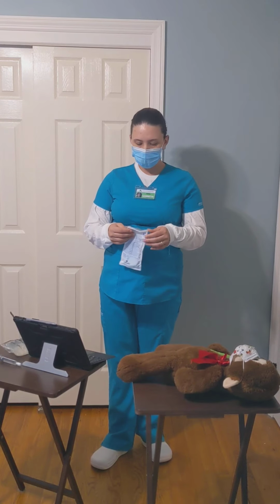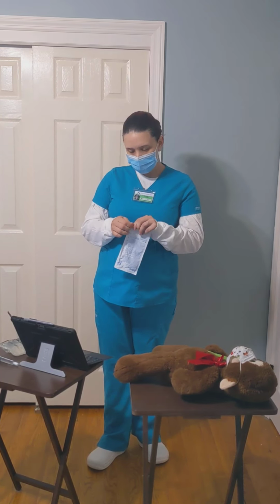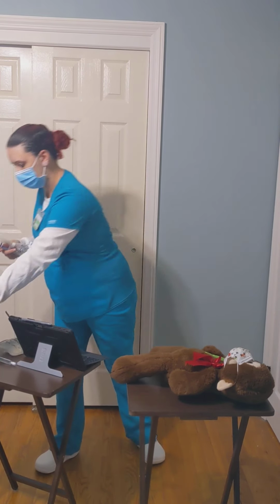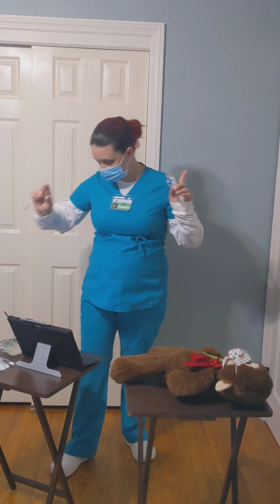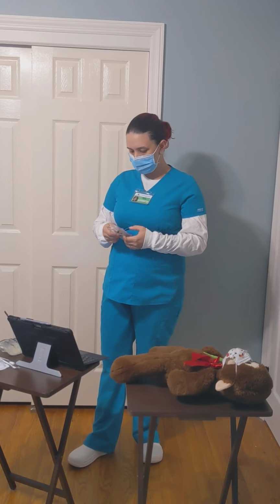So we're going to set up our medication on the pump. Oh, I put gloves on after I washed my hands, by the way. So I'm doing this with clean gloves.